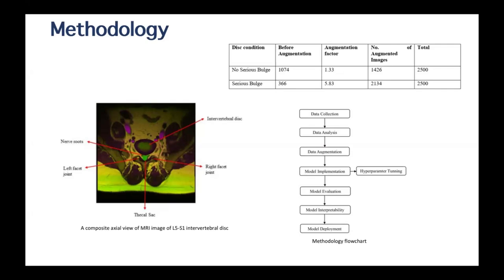So we built our CNN from scratch with all the different layers. After that, we did some hyperparameter tuning, which was a way to improve the model efficiency. So we did tune things like the hidden layer, the regularization and the learning rates and some other parameters as well. Then we evaluated the model on certain parameters like the accuracy, the precision, and the recall.